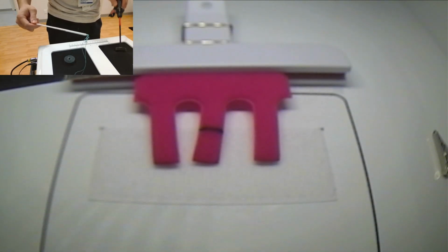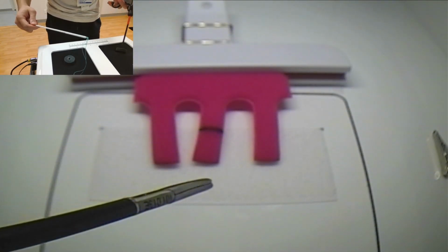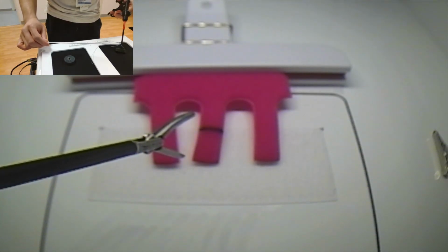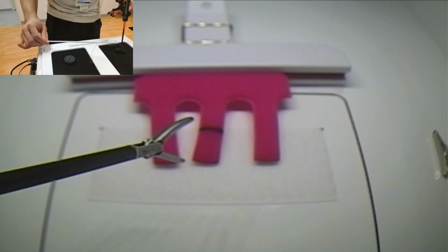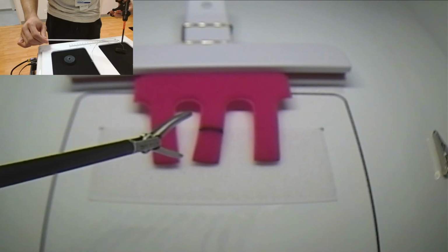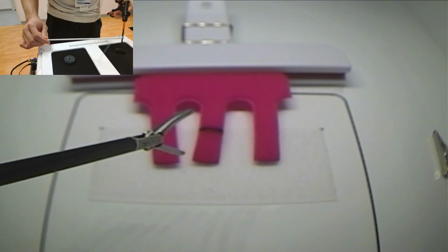And so one of the first things that you do, and also the other instrument here is either a Maryland or a locking grasper. I use the Maryland because my testing center uses the Maryland, and the locking grasper is actually easier because you can let go after it locks. So I think better to practice with the harder instrument.